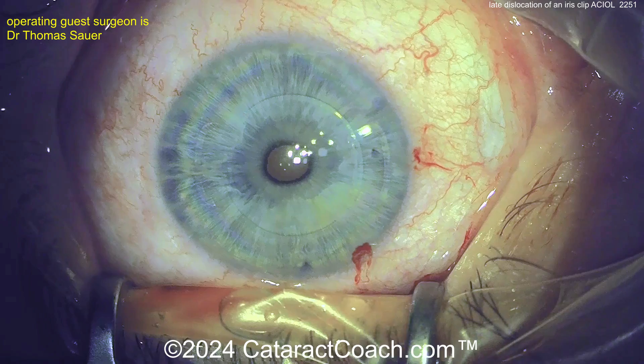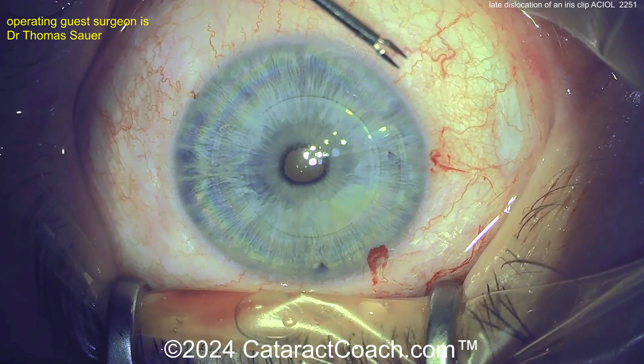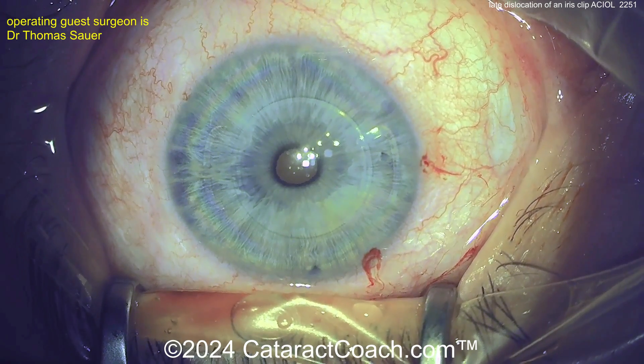Let's see what the surgeon is doing here. You need to get a good knuckle of iris, a good bit of iris stroma, and put it into those clipped arms. The challenge is figuring out if you have an appropriate instrument in your tray to help.